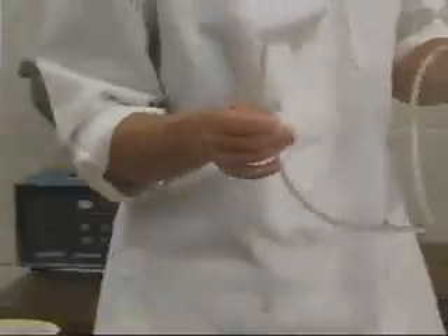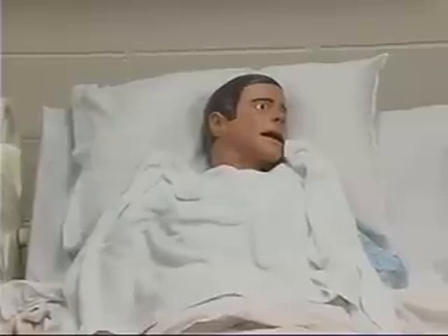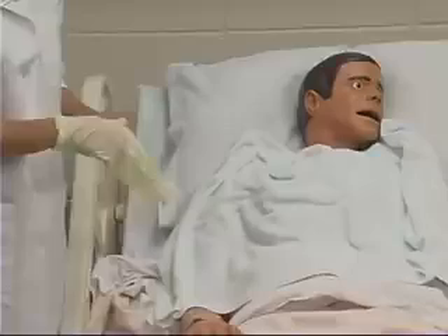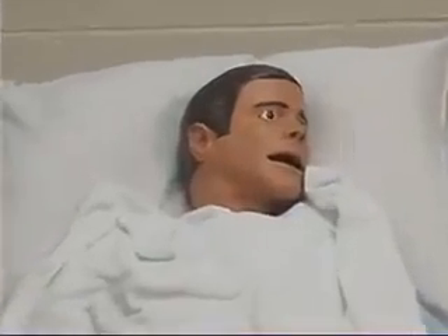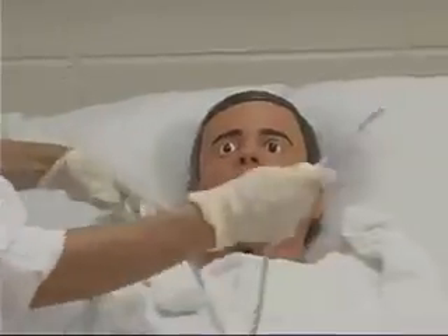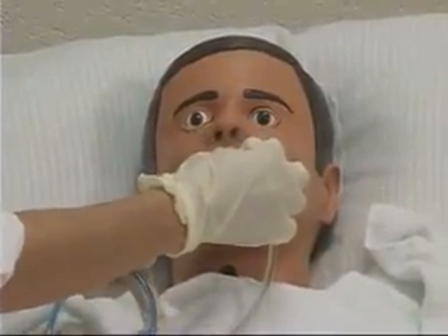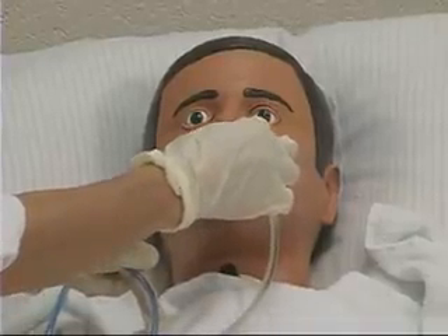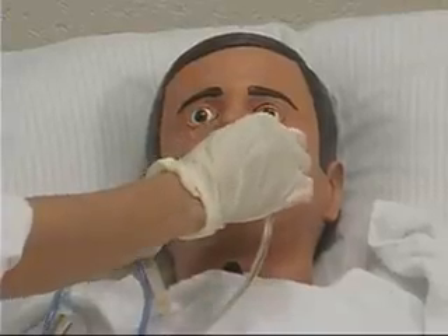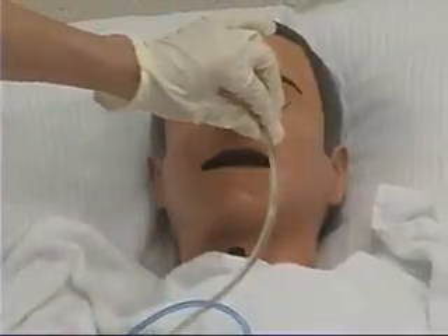Lubricate the first 3 to 4 inches of the tube with a water-soluble lubricant, which facilitates advancement through the nasal passage. With the client's head upright or slightly extended, carefully insert the tube into the client's nostril, aiming it toward the client's ear and downward, and gently advance it toward the client's nasopharynx. Turning and directing the tube helps it conform to the anatomic passageways.